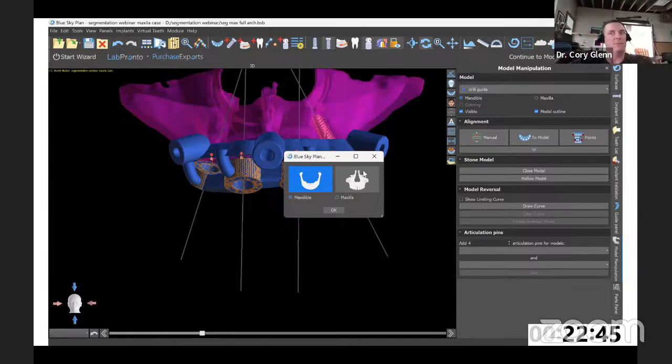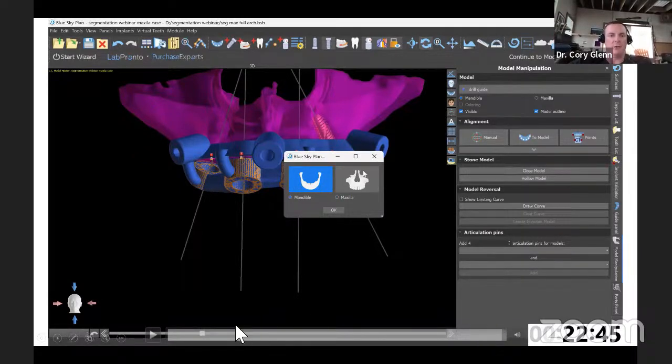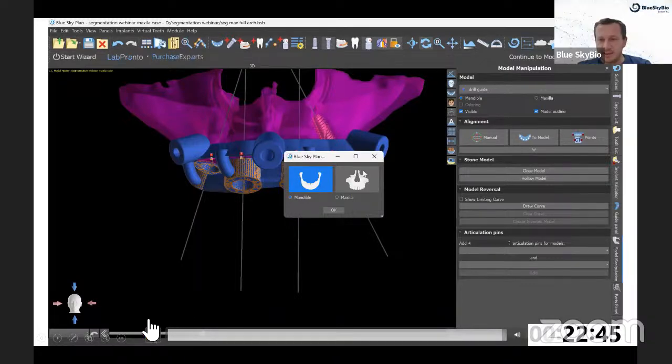Resin's far weaker, but it's much cheaper, so you can make backups. Metal's a lot more expensive, but it's going to be insanely strong. You'll just need the one guide, and it's going to be rock solid. So that's kind of the answer to that. How about the other question? Did you make the reduction plane STL using the add tube function?